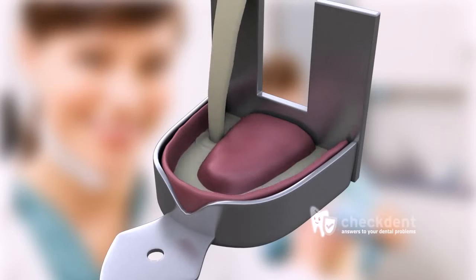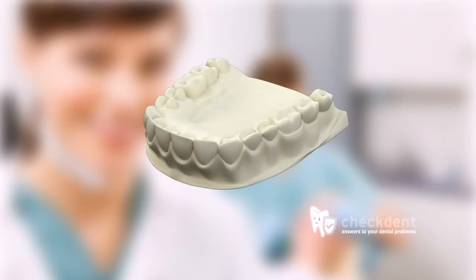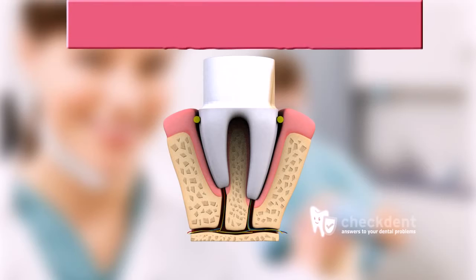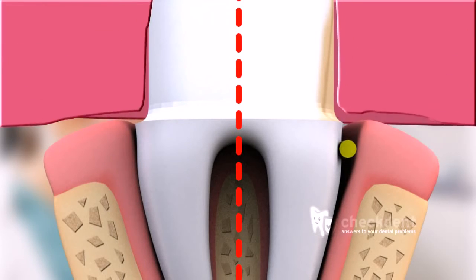Once the technician pours plaster into the impression, this creates a plaster model of the teeth. Because the margins of the prepared crown must fit tightly along all the edges, these edges should be clearly visible to the technician in the impression. Therefore, the impression material should flow right up to the preparation margins. By laying the second gingival retraction cord, the gums are deflected in the other direction. When the second gingival retraction cord is removed just before the impression is taken, the impression material will clearly record the preparation margins. On the right of this animation, the preparation margin is clearly visible.